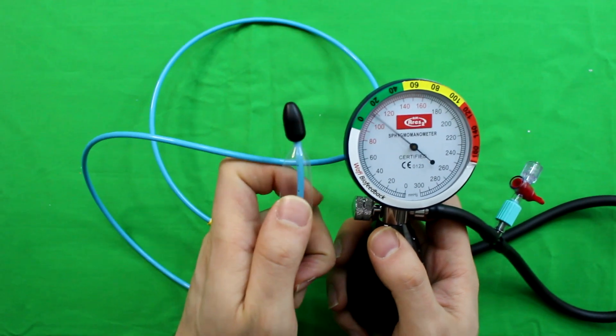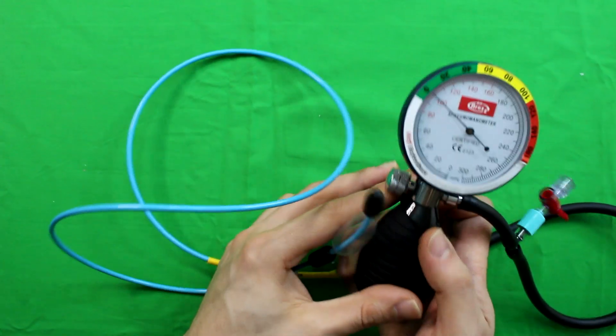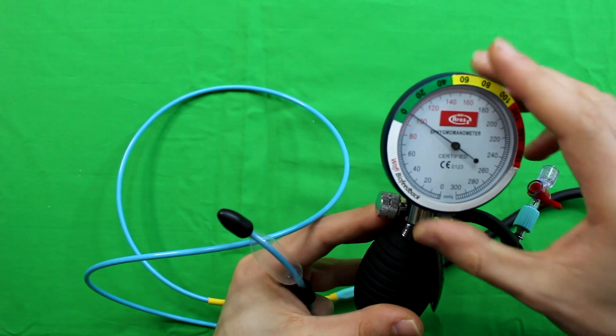After the balloon is placed into the breech, reset the calibration ring by bringing it to the level of the pointer.